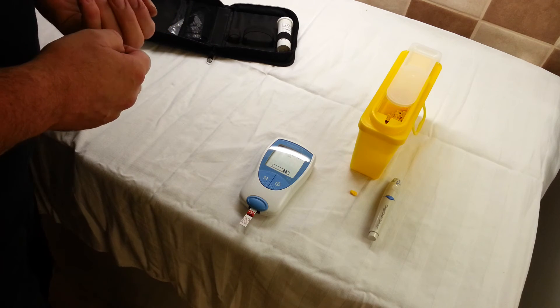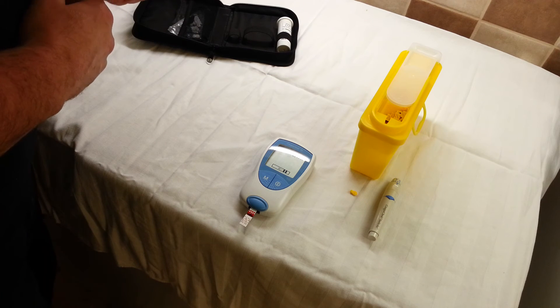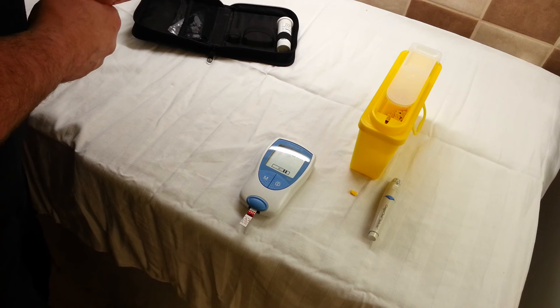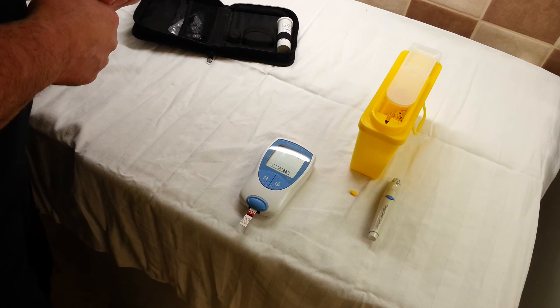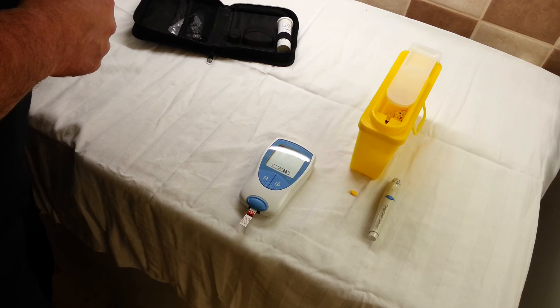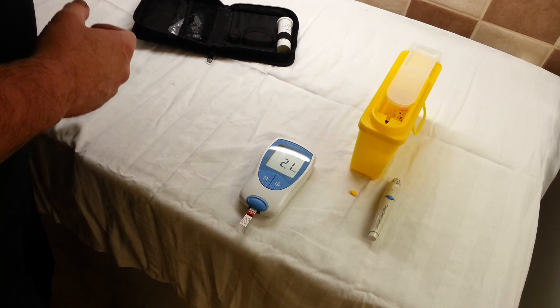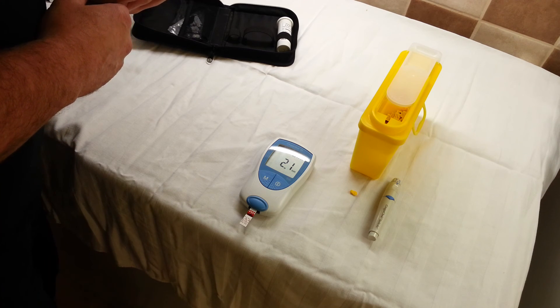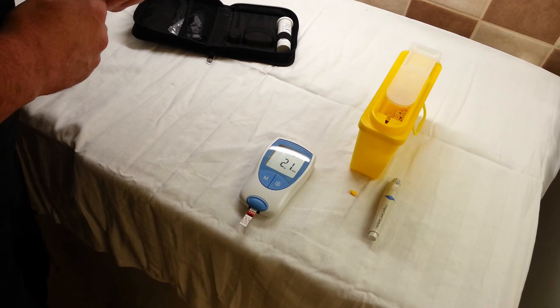It beeps to say it's got a sample of blood, and then it comes up with a QC and a tick — so that's done the quality control checks to ensure that it's going to measure properly. And then it's just a little bit of waiting. That's come up as a 2.1. I'll record that in my warfarin book and ring that into the clinic tomorrow.